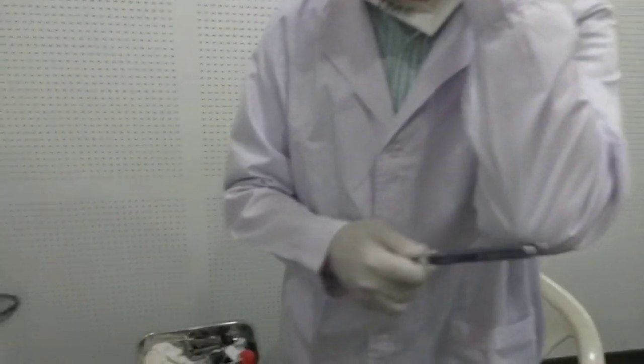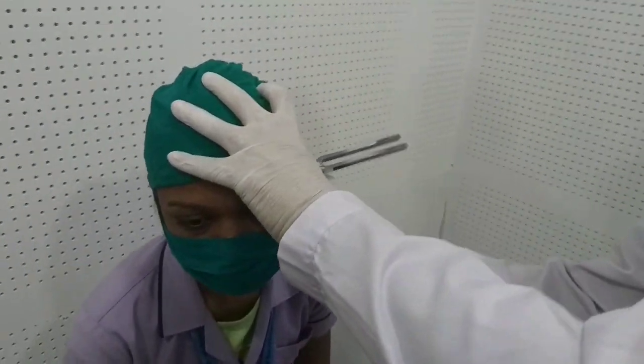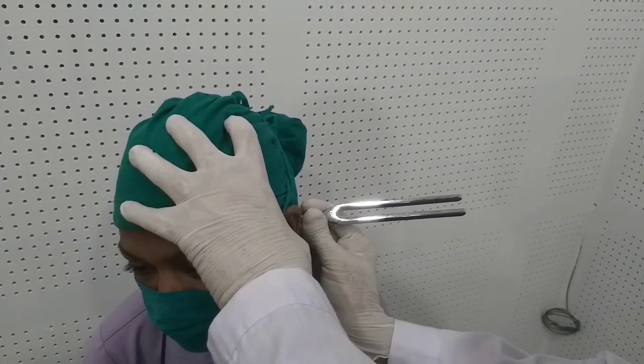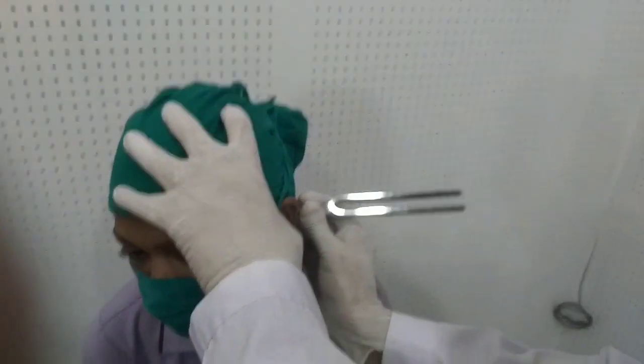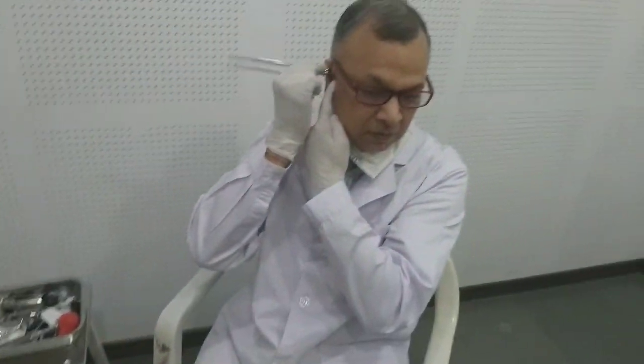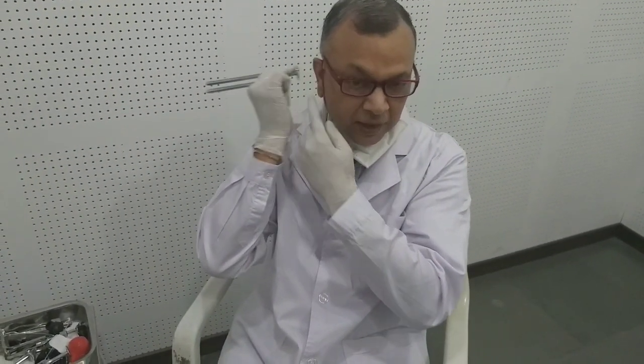After charging the tuning fork, I will put it behind the mastoid bone and I will occlude the external auditory canal. When you stop hearing, let us know. [Patient stops hearing.] Now I will put it on my bone. — I can't hear. It means the patient doesn't have any sensorineural hearing loss. The patient can have conductive hearing loss in this case, but does not have sensorineural hearing loss. If the absolute bone conduction test is normal, it means the patient doesn't have sensorineural hearing loss.